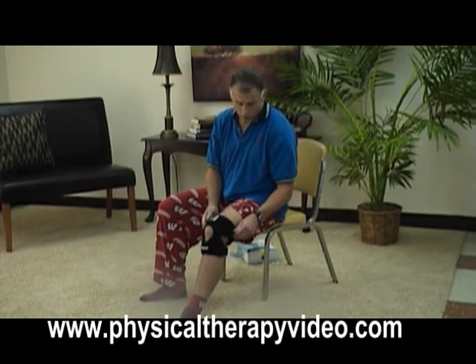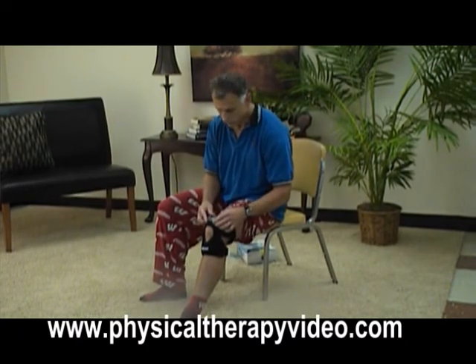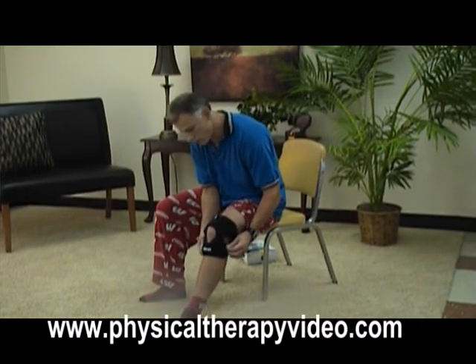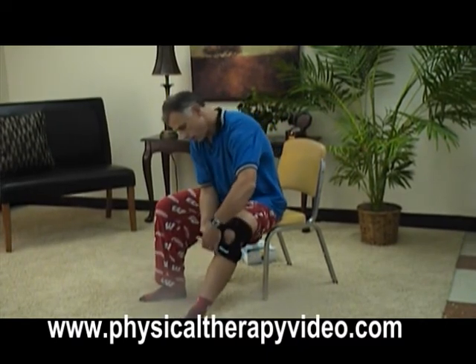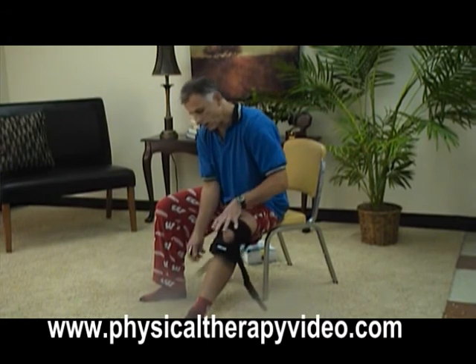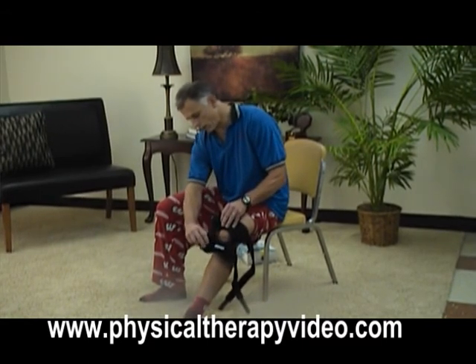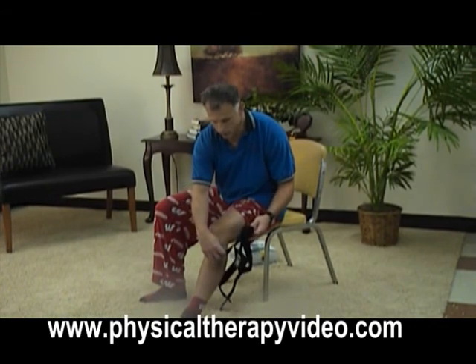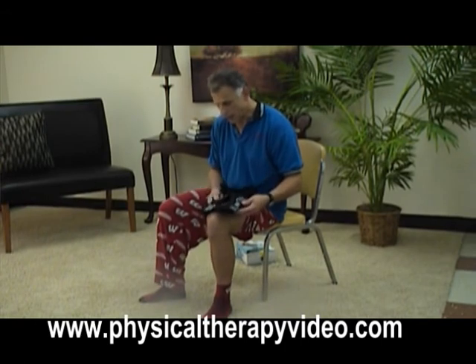When you're done with it at the end of the day, simply turn it off, take this off, put it back on the charger, and take it off your knee. Always be careful pulling this off your leg so you don't damage anything with the electrodes. Take your time with it. Keep them clean so they stick for the next usage. It's a wonderful unit, a good way to manage knee pain.